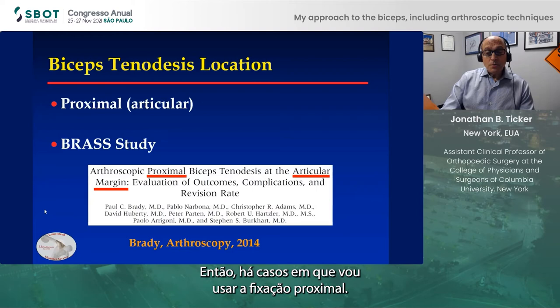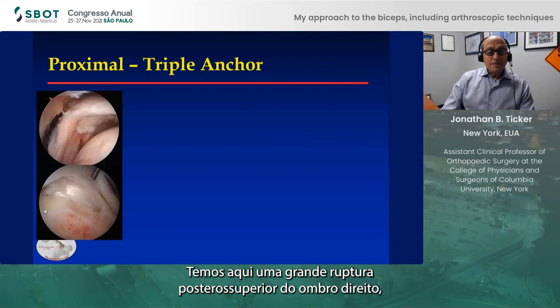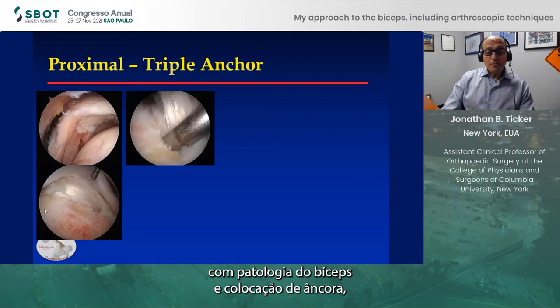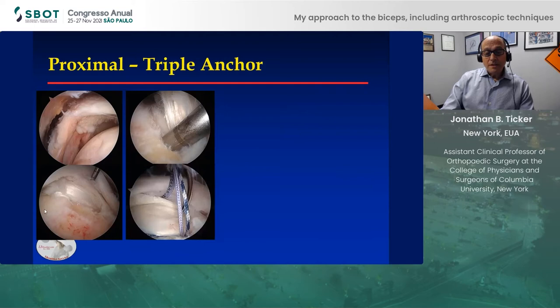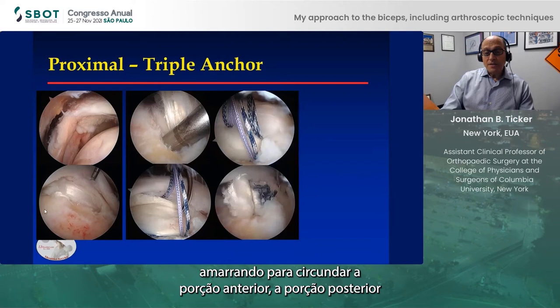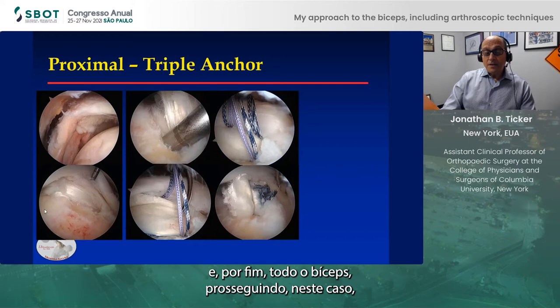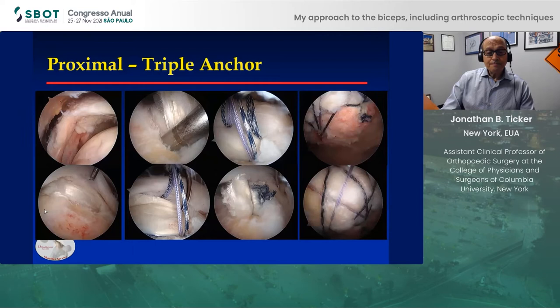There are times where I will place fixation proximally. This is a massive right posterior superior tear with biceps pathology. I'm placing the anchor just lateral to the articular margin at the biceps groove. I'll pass sutures around and through the biceps and tie them to encircle the anterior half, the posterior half, and then the entire biceps, and then proceed with a double row repair.